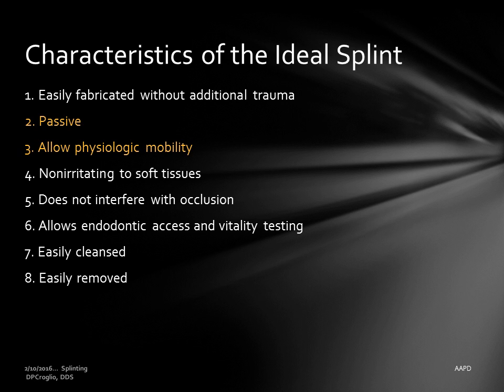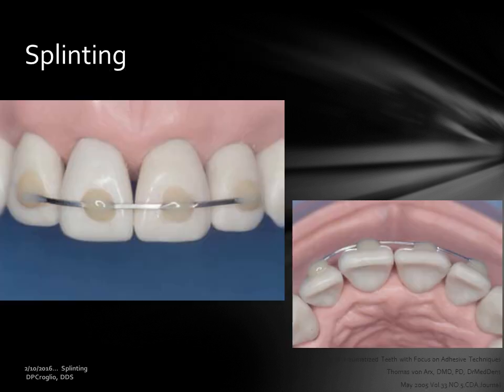A splint also needs to be non-rigid to allow for slight movement of the teeth. Although most splints are not left in place for more than 7 days, ankylosis of the splinted teeth can occur if the ligaments are not allowed to stretch and compress normally.